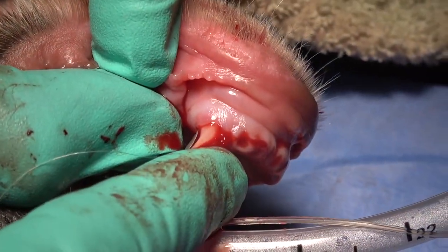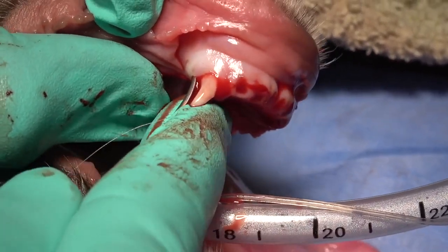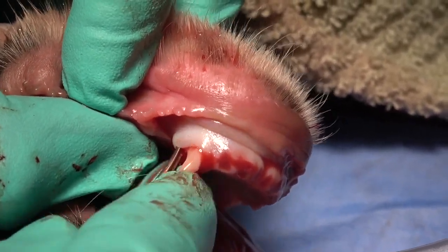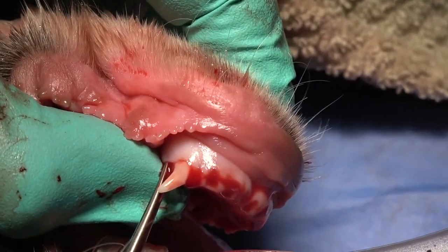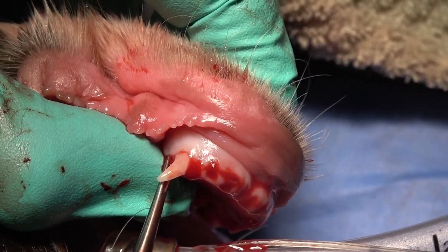On the distal aspect, we're using a convex luxating elevator to do the same thing. Once the luxating elevator is placed, we're going to torque it again with the root torque toward us. Note that some pressure is being applied with the shaft on the crown as well.